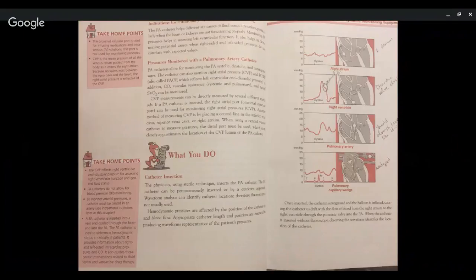Pressures monitored with a pulmonary artery catheter. PA catheters allow for monitoring the PA systolic, diastolic, and mean pressures.